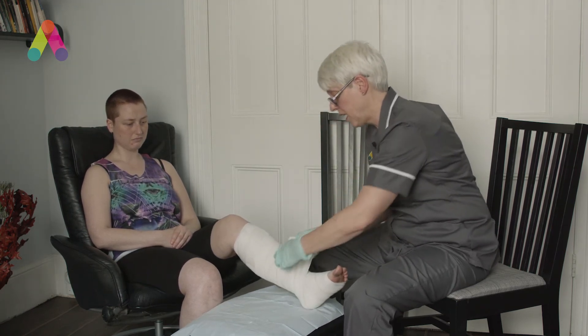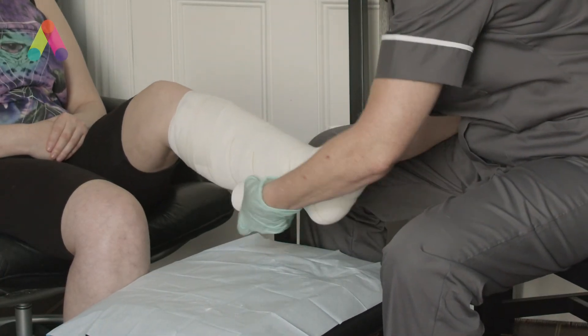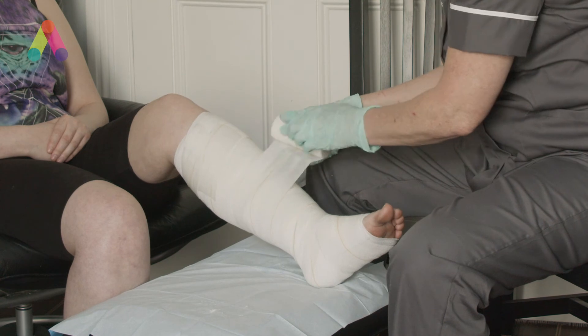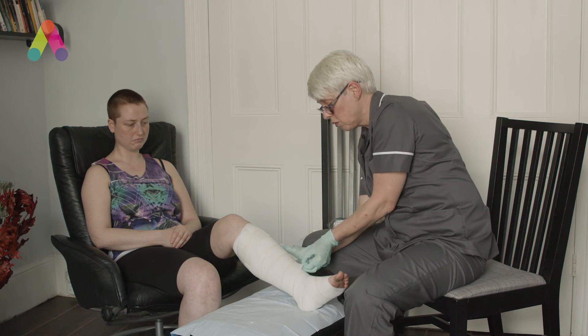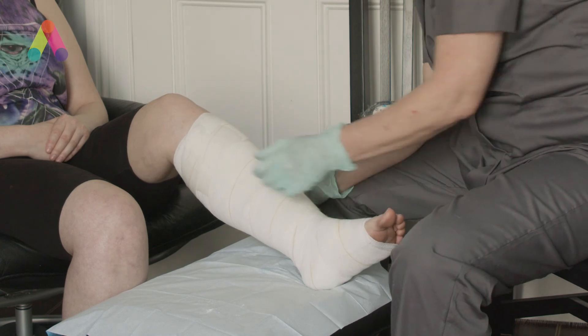For Faith today I'm just going to go up in a spiral bandage. You're looking at 50% overlap for this bandage, and it's a good level of squeeze. What you're wanting to do is make sure that you've got some firmness, so you can feel the tension on your fingers.